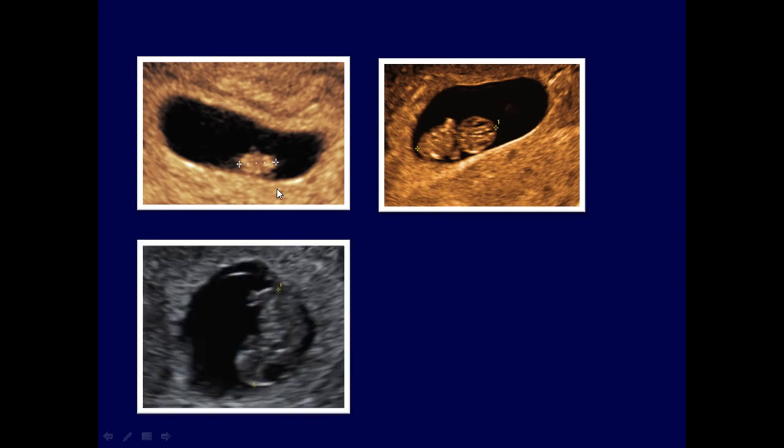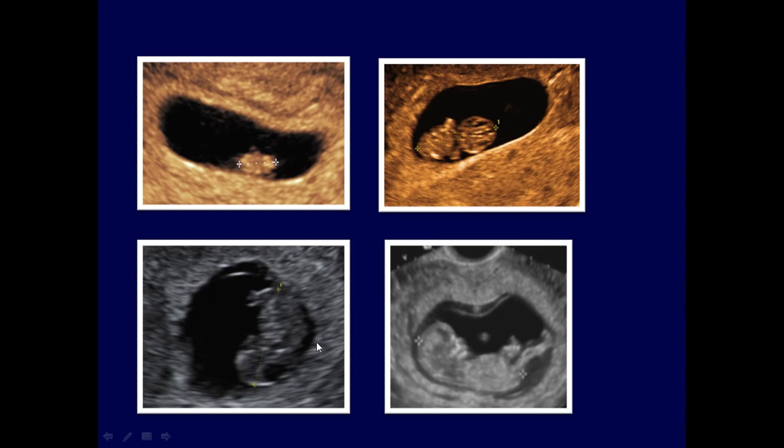At 8.3 weeks, the embryo has a C-shaped configuration. The cephalad end becomes prominent and contains an easily visible sonolucent structure. It is the developing rhombencephalon. The rump may reveal a tail-like appendage. By 10 weeks, crown rump length is 30 millimeters.